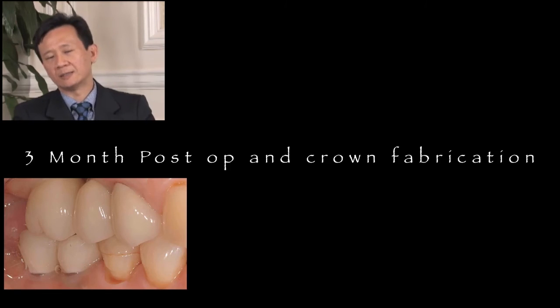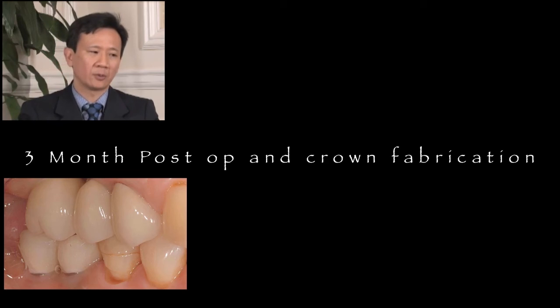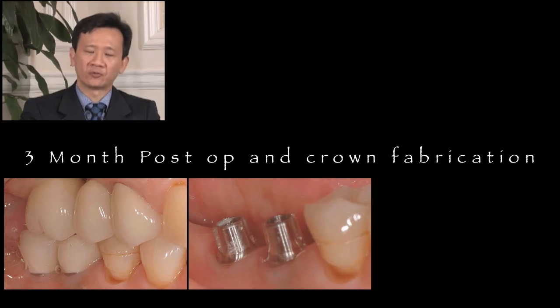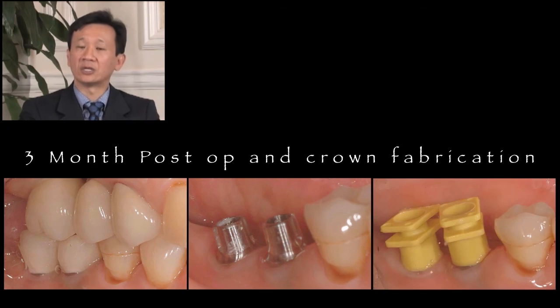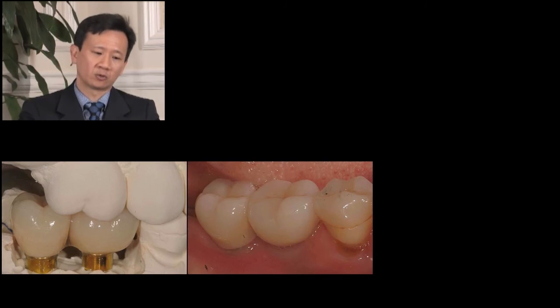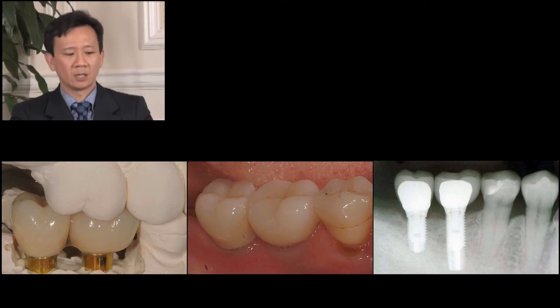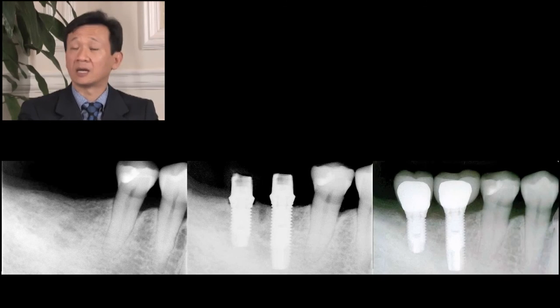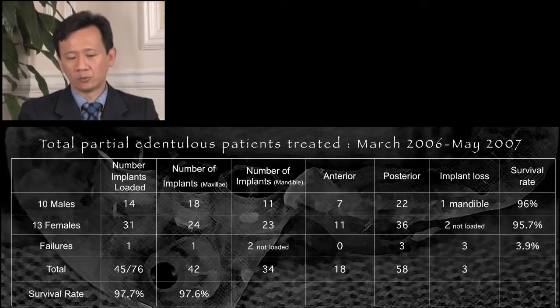As the patient and implants heal, at 3 months post-op we can remove the provisional restoration, and now it becomes a restorative procedure by placing the impression copings, making an impression, and then re-cementing the exact same provisional restoration. In the laboratory, we fabricated 2 individual all-ceramic restorations, Procera crowns, and cemented them in place. We document the patient before, at implant placement, and at cementation.